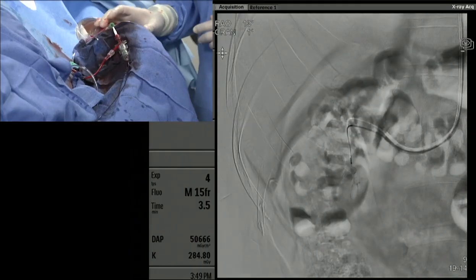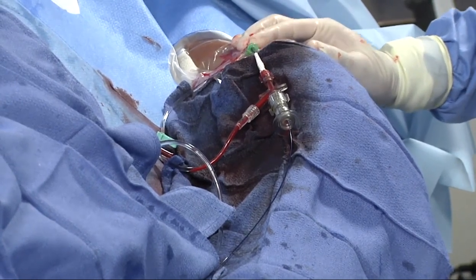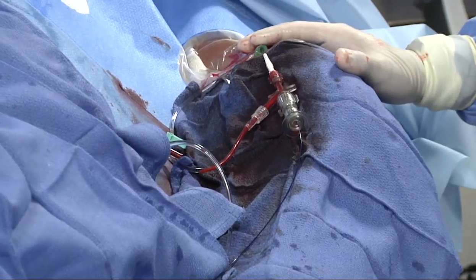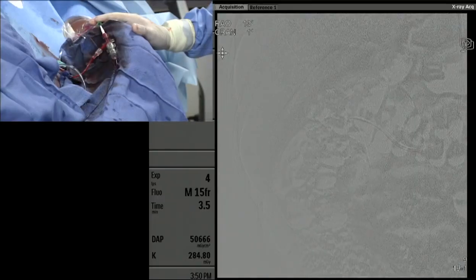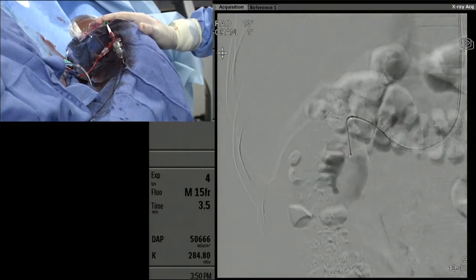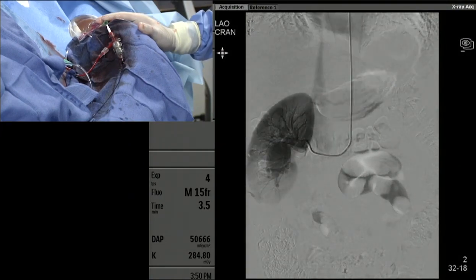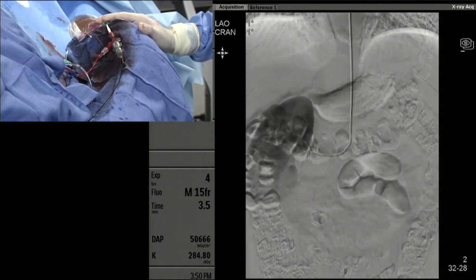We have a couple different things that we're doing here. This is a 6 French slender, so it allows us to put in a 6 French guide. The first thing we did, we'll play the run in a second, was we put down a transradial, and we did an angiogram. Let's show the first run we did. And we were thinking we might do an aortogram, but we have such good pre-procedure imaging that we just popped right into the renal with the Sarah, and you can see how this really depicts the problem very, very well.